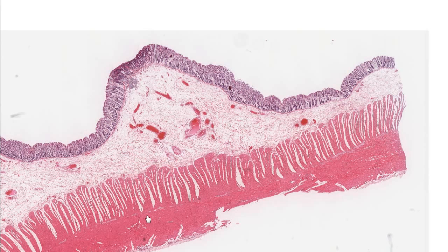So that's where we are. This is obviously taken from a large resection specimen. But what we're going to be focusing on is a little bit of mucosal change in this area up here. So let's go to higher power.